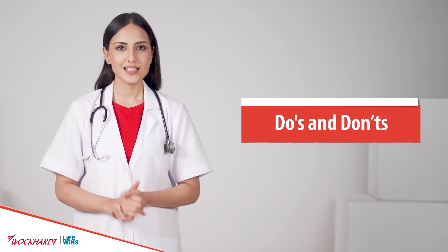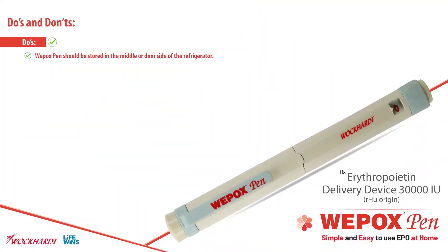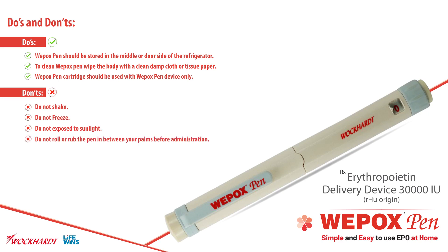Do's and don'ts. Do's: Wepox Pen should be stored in the middle or door side of the refrigerator. To clean Wepox Pen, wipe the body with a clean damp cloth or tissue paper. Wepox Pen cartridge should be used with Wepox Pen device only. Don'ts: do not shake, do not freeze, do not expose to sunlight, and do not roll or rub the pen between your palms before administration.